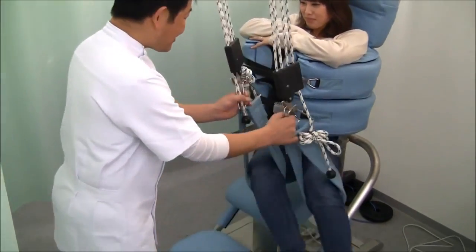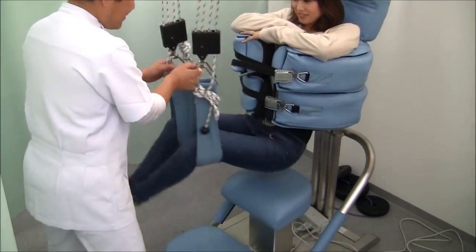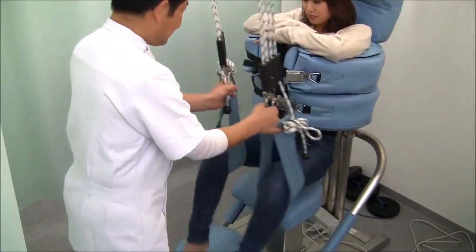Chapter 16. Loosening the lumbar, hip, and leg joints. Make sure to watch the video so that these maneuvers don't elicit any pain, and have the patient relax as much as possible.